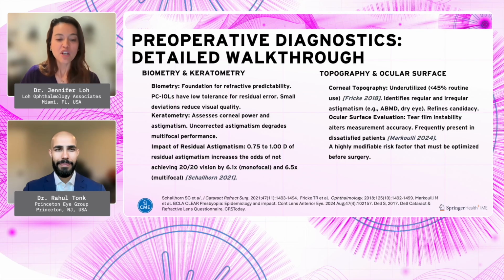Of course. So I want to dovetail on our excellent discussion previously about the underutilization of presbyopic IOLs and why that may be, to really dive more into now the process of identifying patients that could be good candidates for a presbyopic IOL, what testing to perform, how to analyze those tests, and also then how, most importantly, to select the right technology for the right patient. And even I'd like to touch on a little bit of how to manage some of those unhappy patients that we may have. So Rahul, first take me through how you first assess these patients.